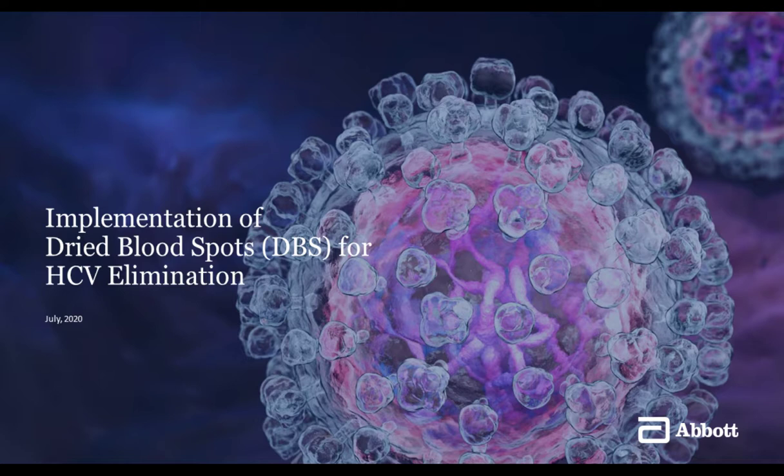Emmanuel, we have a two-part question: two-thirds of the sites observed false positives with DBS. Since HCV does not integrate into cells like HIV, proviral contamination would not be an issue. Could you comment on potential causes of these false positives and whether procedural steps could contribute to this performance?